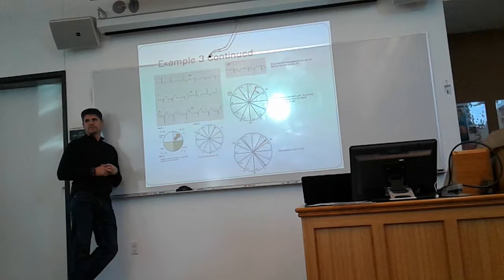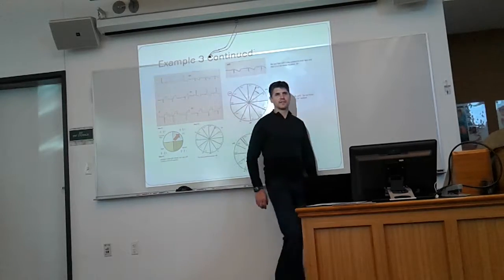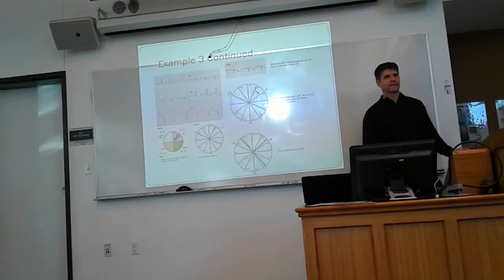Does that make sense? Our EKGs are never going to be that clean because of all the impedance and all the other things we have to deal with, so I would never ask you to be that accurate. But if everything was perfect, that would be the most accurate answer. Make sense? Questions on axis and determining the axis on everything?